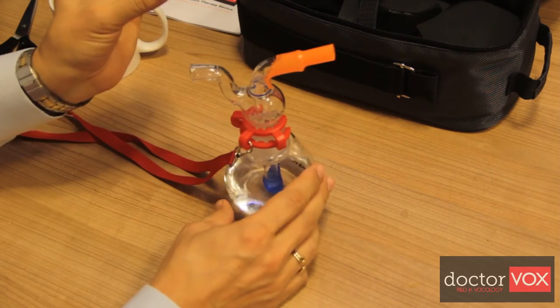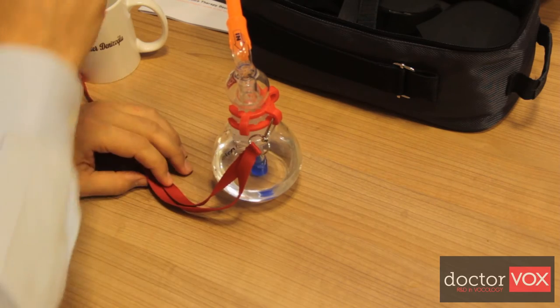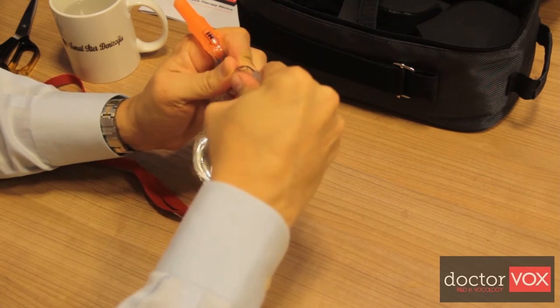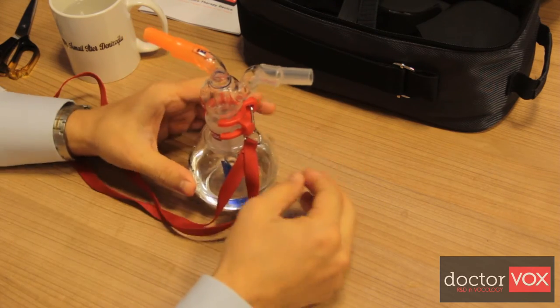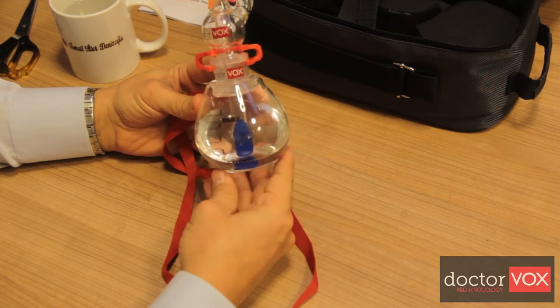Last but not least, this inhalation outlet mouthpiece can be easily mounted by dipping it into water. And this is Dr.Vox.